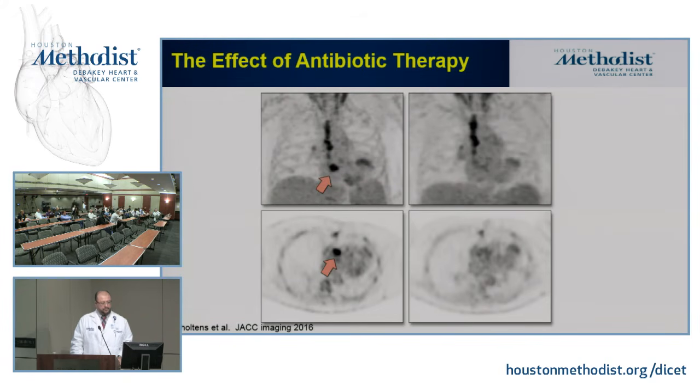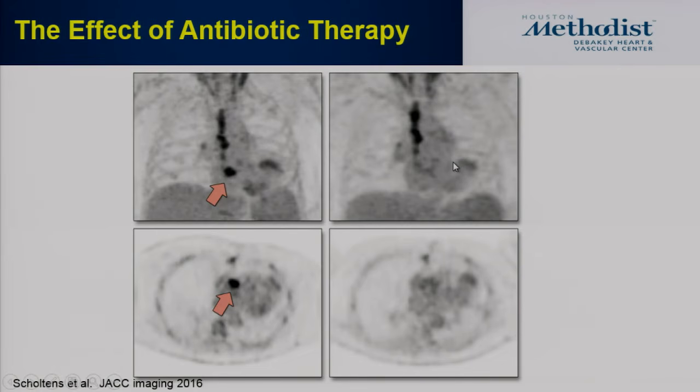We see most of the spleen when we do these studies, so we can actually say the spleen shows no evidence of infarction. That's not an issue. We always say it if it does. All right, and then finally, when patients get antibiotic therapy, you can start to see that there is some decrease in the FDG uptake among these patients.